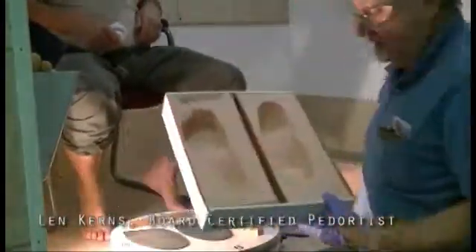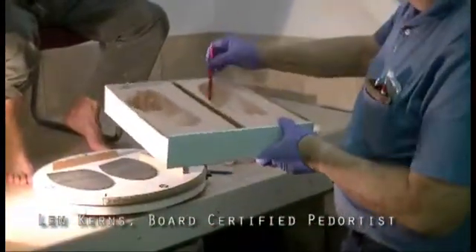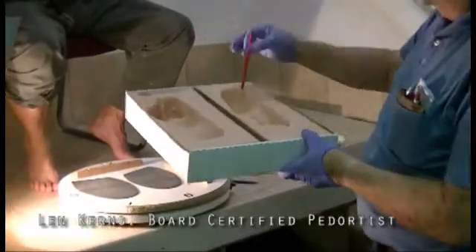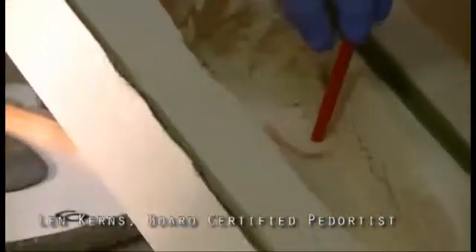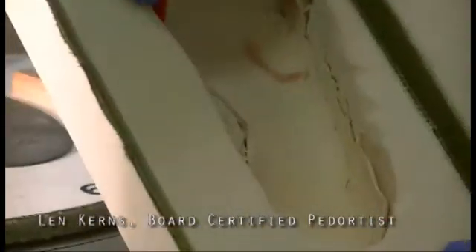Just relax your foot over here. And now again you could see, I'll turn it this way, you could see the foot is vertical. And he has a normal pronating foot and a pretty straight leg if you watch them walk. So here it is vertical. Here's the fifth, approximately the same depth. You see it? And the first is higher.